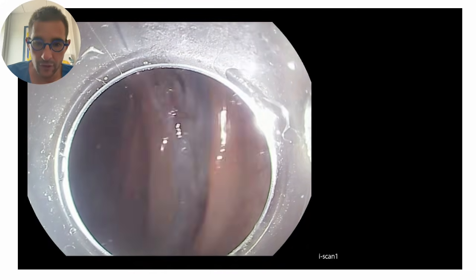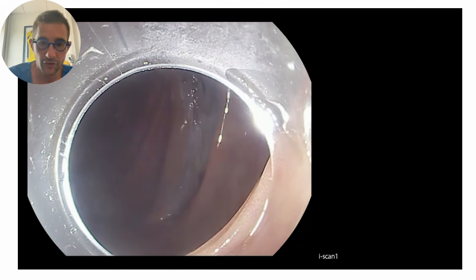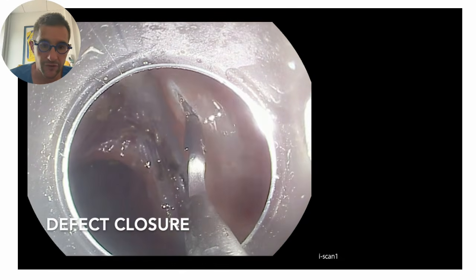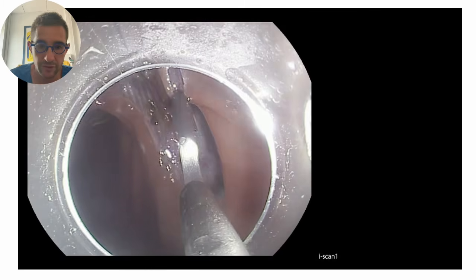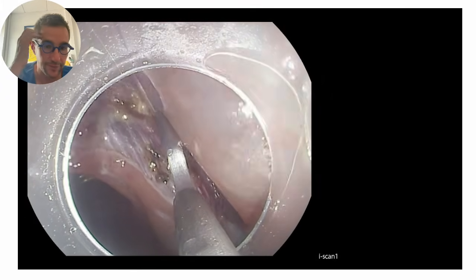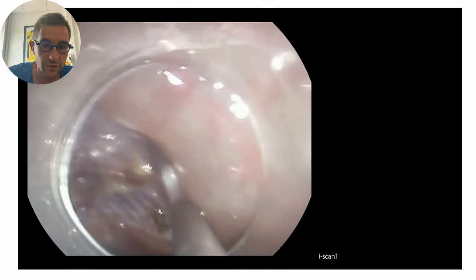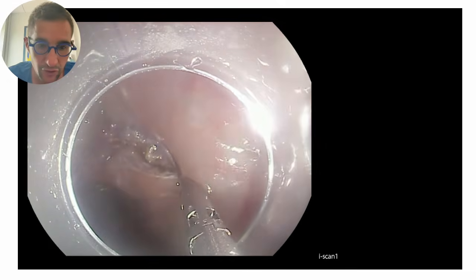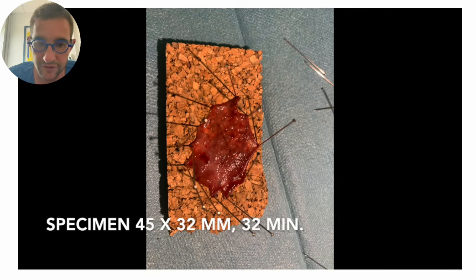So we closed the defect after, to be sure to see it, with the small incision method. It means we do small incisions and catch it to avoid the clip sliding. Now you can also use some clips with teeth to catch the mucosa better, but a simple way to do it is also to do small incisions, and we could remove this recurrence quite easily with good results.